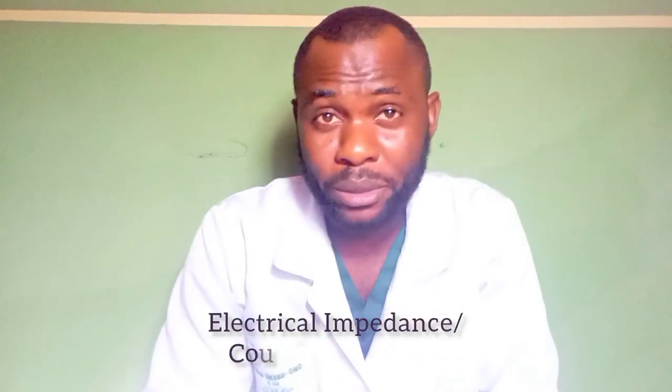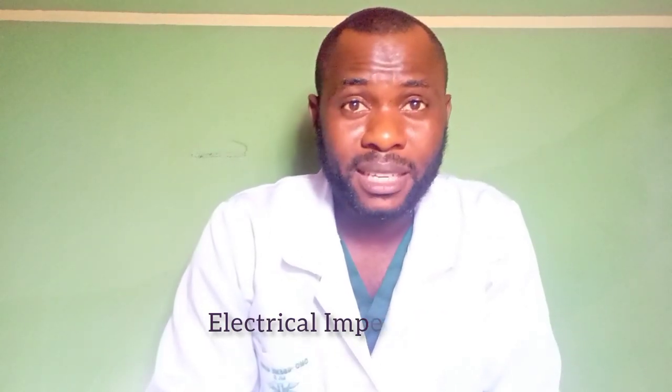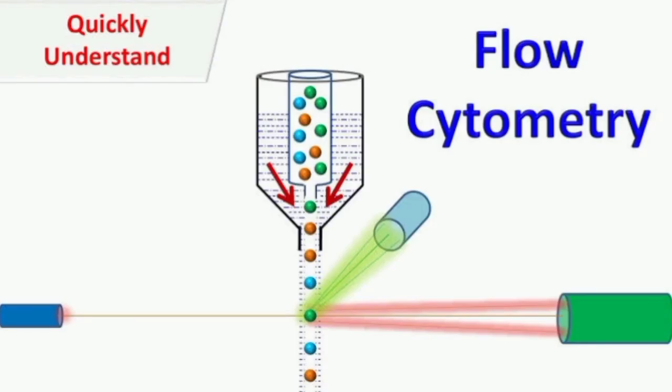So the principle of the auto analyzer, or the traditional method for counting cells, is the electrical impedance, also known as the Coulter principle. It is almost used in every hematology auto analyzer, where whole blood is passed between two electrodes through an aperture or an opening so narrow that only one cell can pass through at a time.